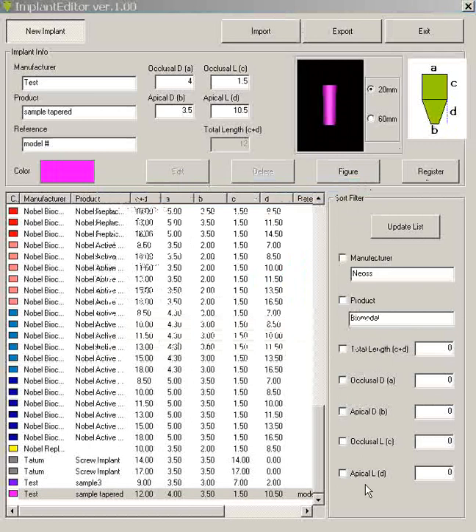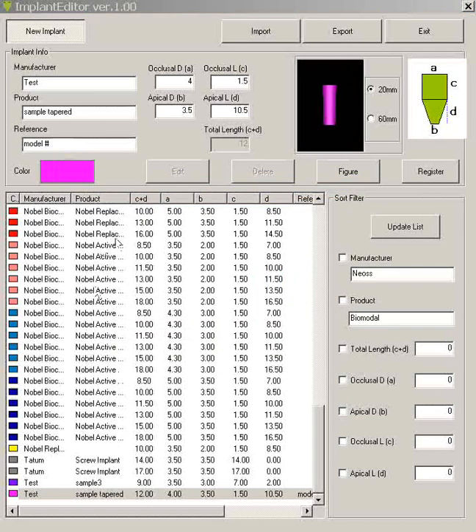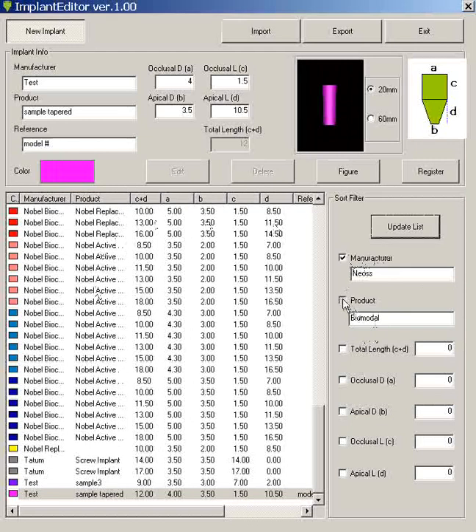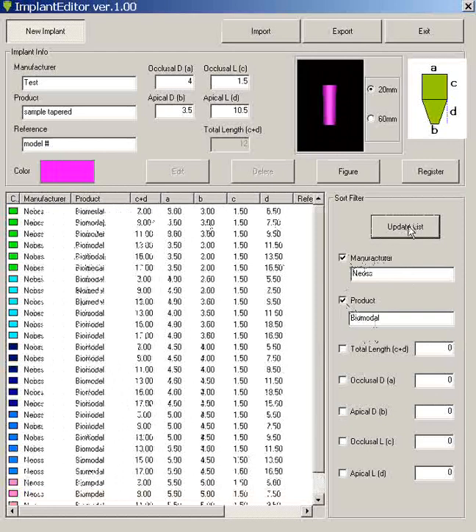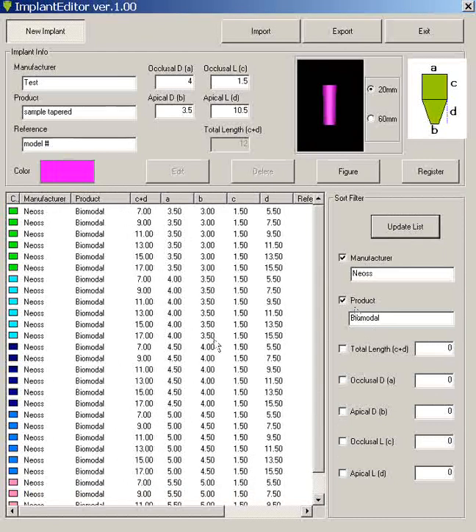Now if you are having a more extensive implant library file and you just want to load a particular manufacturer or product, here you can click. Here I've just inputted NEOS and the product name and you can click these and click update. Check the boxes, hit update list. And then you're going to get the list of only the NEOS Biomodal implants that are selected.